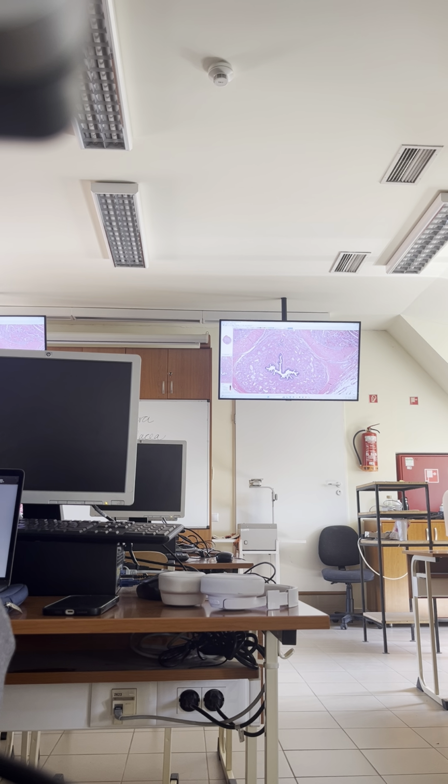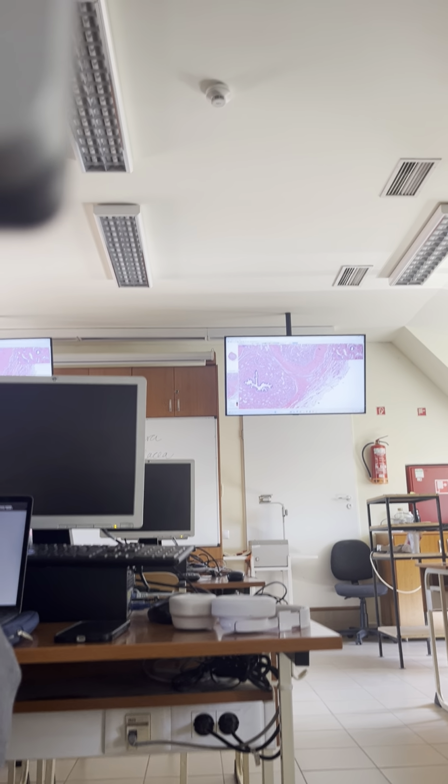Now, yeah. There's these glands that there's ducts from the urethra go to. You mean this? Yes, the small. Yeah, exactly. I don't really understand what's their purpose. Such a structure is probably a paraurethral duct. Have you heard about them? I drew it. Not with us, not with our group. Oh, not.